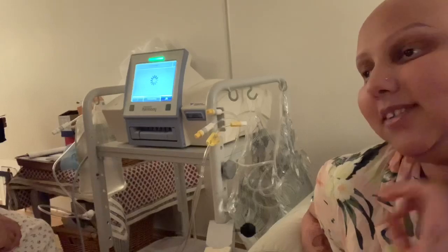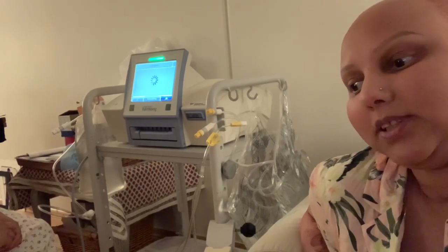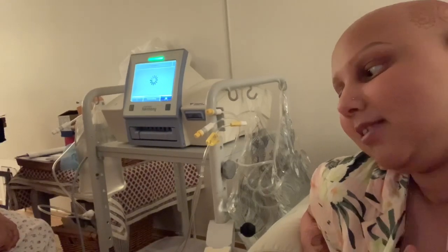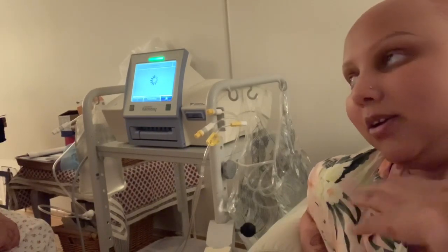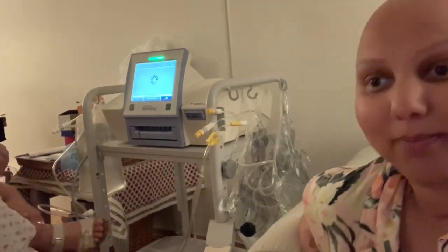The fluid sits in my body for about an hour and absorbs all of the toxins, which normally the kidney would do. But the fluid does it instead, and then it's drained out and replaced with clean fluid. This happens six times throughout the whole night.